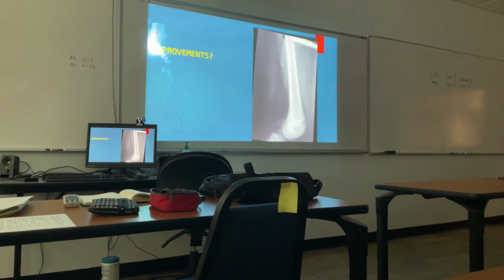So if you had an office with a bunch of people taking x-rays, you could get each person's initials on a label so you know who's doing it. Okay, did everybody hear that? So in a multi-doctor office with multiple CAs taking x-rays, everyone will have their own set. Then we know if there's bad x-rays taken, it should be the marked ones, and they have to go into remediation. Fired. I'm kidding.